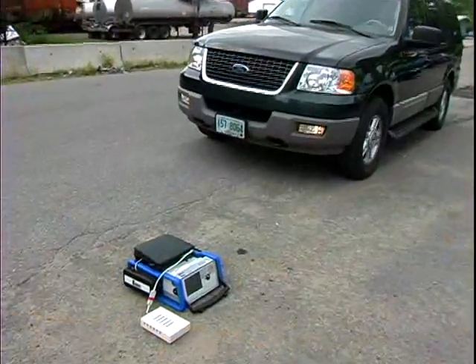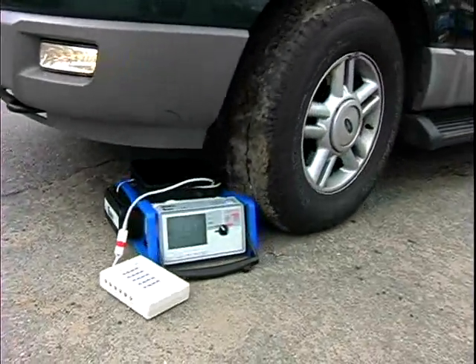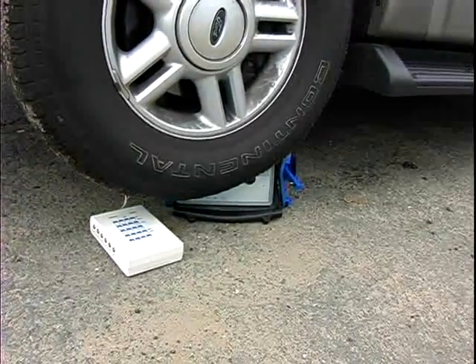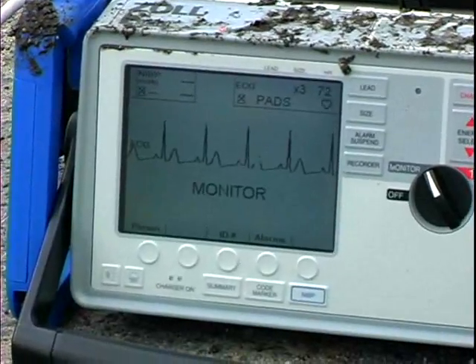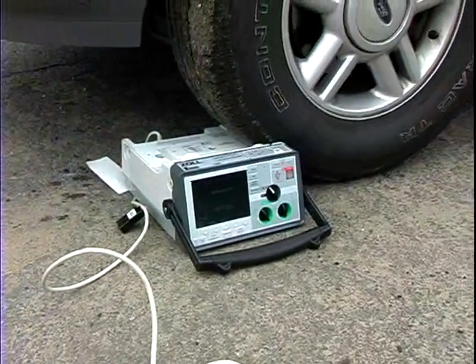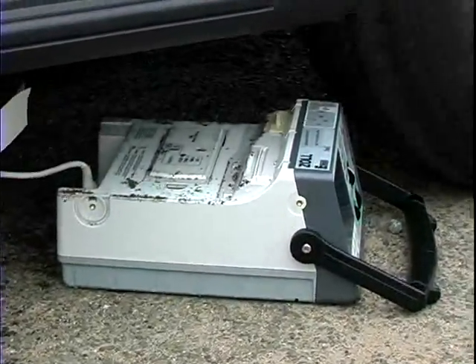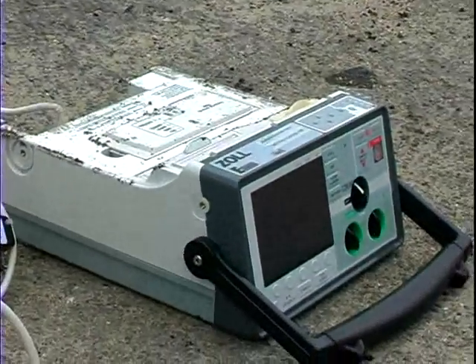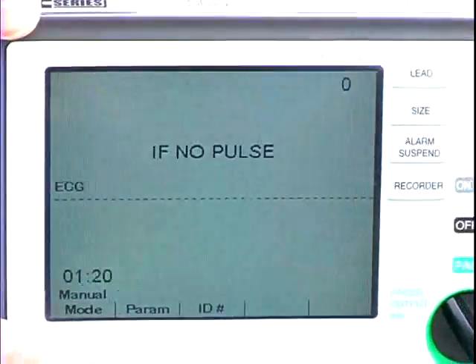We then decided to try to run the device over, so we had a Ford Expedition, which weighs close to 6,000 pounds. You can see it dug into the roll bar quite nicely and bent that over, but as we drove over the E-Series, there was no damage whatsoever. We decided to try it without the roll cage — we were getting a little confident — and as you can see, once again no damage, because the outer housing of the E-Series is beefed up very nicely to withstand EMS abuse. Once again, changing the display, and it's quite viewable.